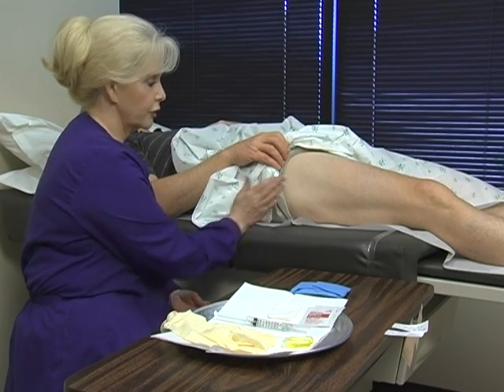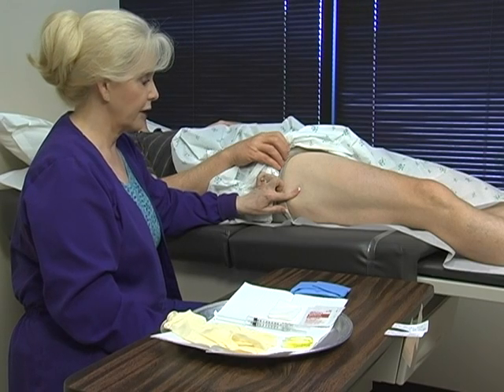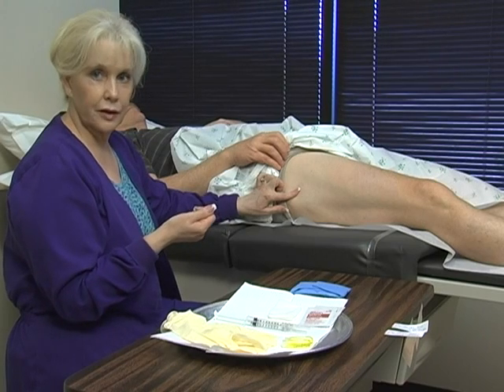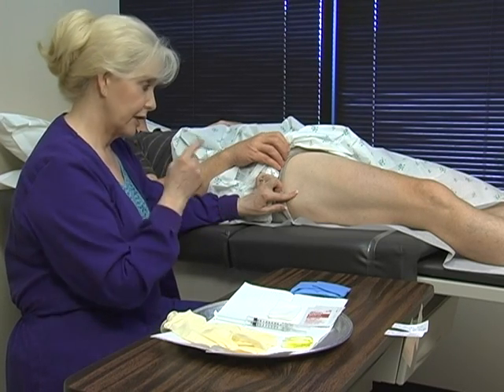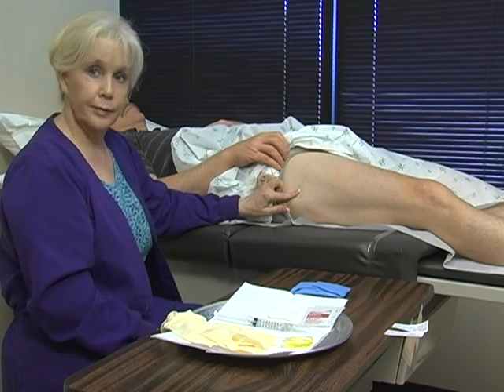I don't usually use a surgical marker to mark the site. Many times when you're cleaning with alcohol, the marker tends to bleed a little bit. So I focus on infiltrating with the lidocaine and keeping my eye on the bleb rather than actually making a mark.